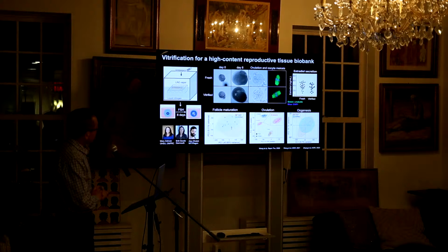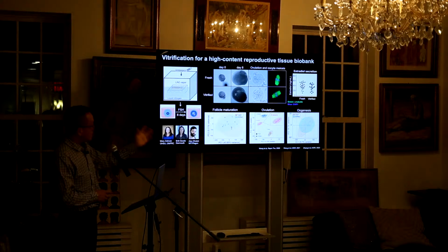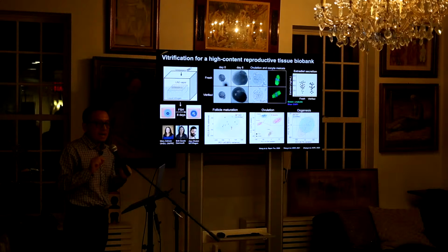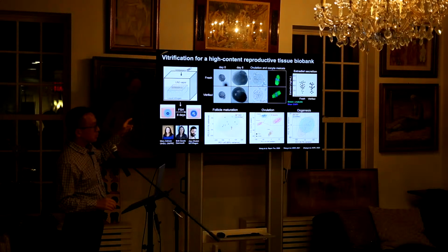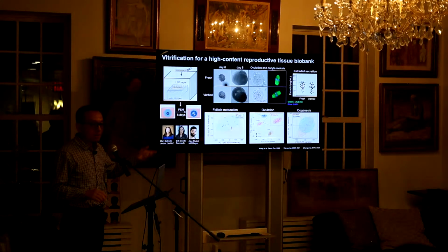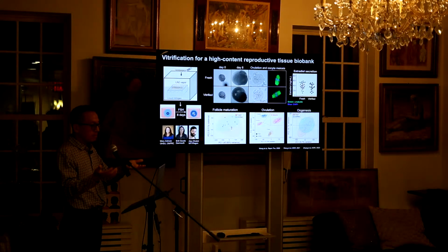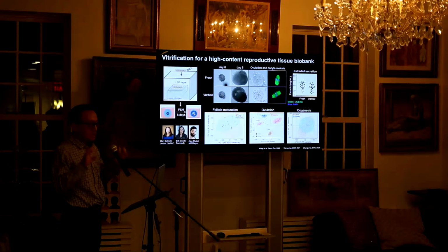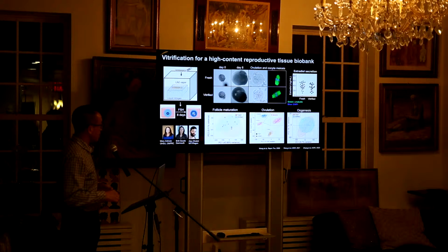For our vitrification project, just one slide and I will quickly go through. Vitrifying oocytes is relatively standard, and it works so well. But if you want to vitrify organoids or follicles, either for fertility and IVF purposes or for a toxicology biobank, it is a totally different story. If you don't have a good recipe, you break the gap junctions between those cells and the connection between the oocyte and somatic cells, and then the follicle cannot survive or be cultured.